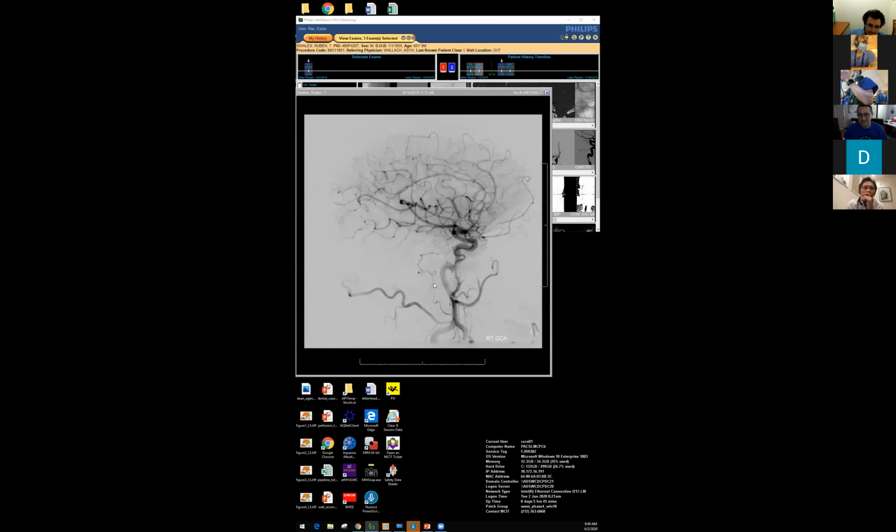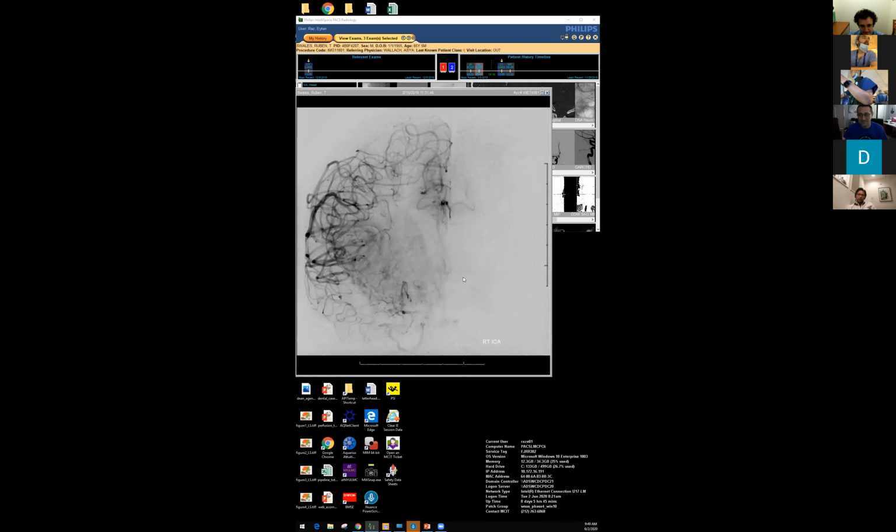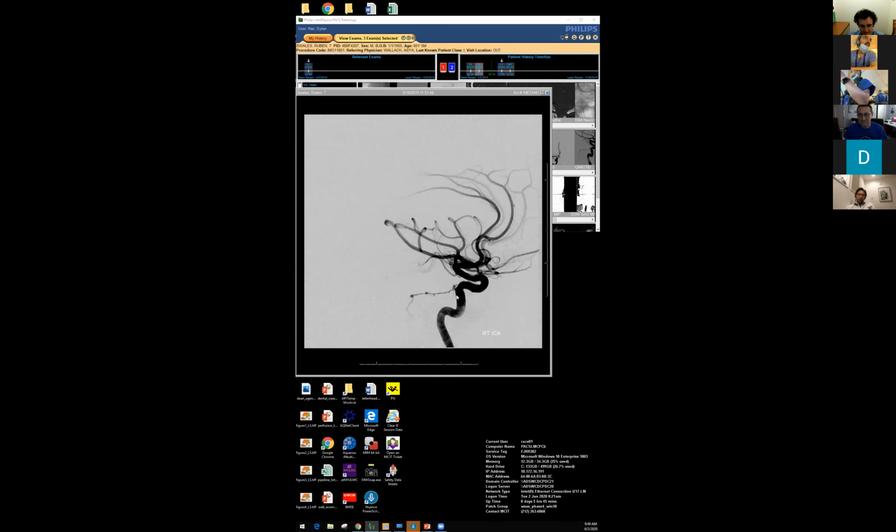And here this is very similar to the one that Kitty Pong showed. So we have a common carotid artery injection, and we see this early opacification of this vein here, and this fistula is supplied by this meningohypophyseal trunk. ICA injection to understand this better.